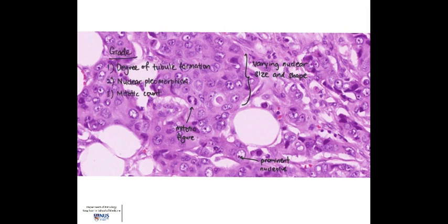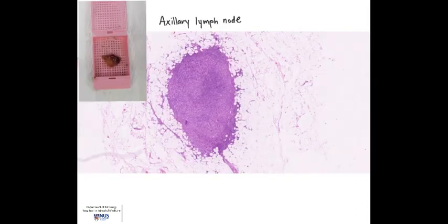In summary, grading of ductal carcinoma is determined by the degree of tubule formation, nuclear pleomorphism, and mitotic count. Here is a microscopic image of an axillary lymph node and a corresponding gross section.